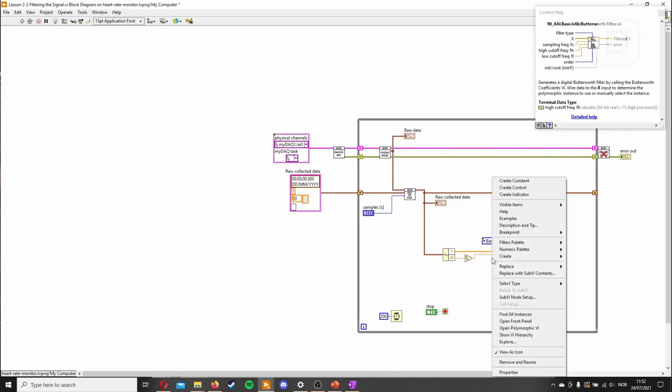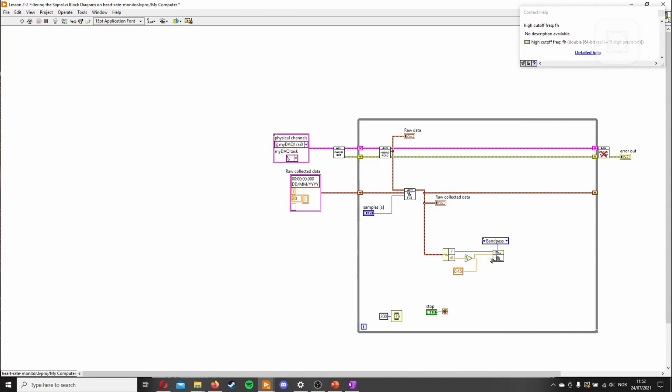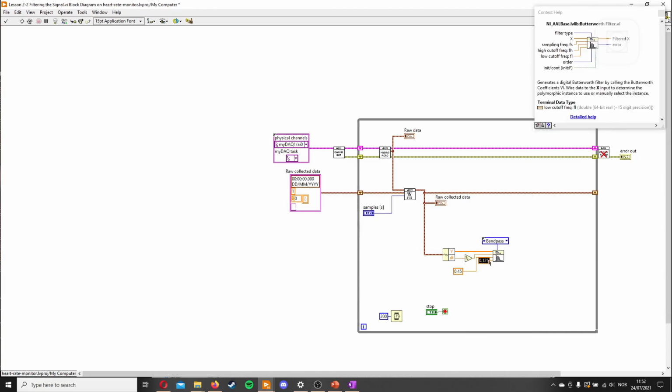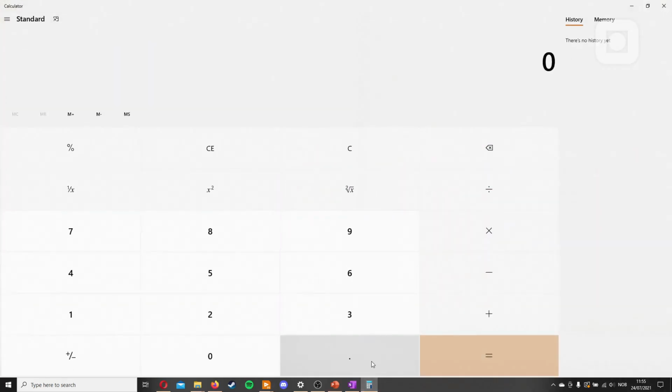We then need to decide the cutoffs. So this is the higher cutoff, and this will be the lower cutoff. So to figure out what we want to put in here, we need to calculate. So the person will probably be standing still, sitting still, as this will be a sensitive thing. So the heart rate won't be too much. It will probably be at maximum 120, maybe 140. So let's just say 180 to have the limit a little bit over what we potentially will get.